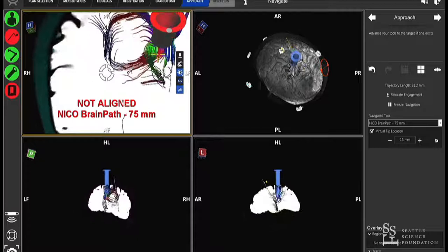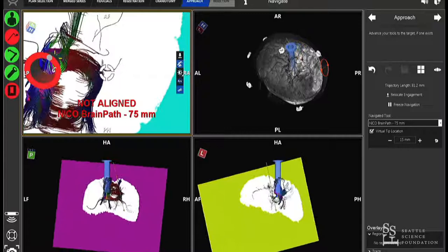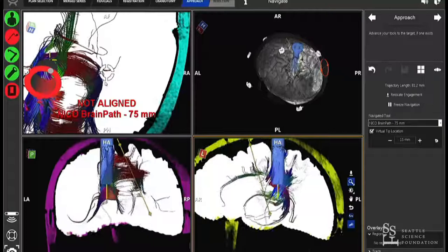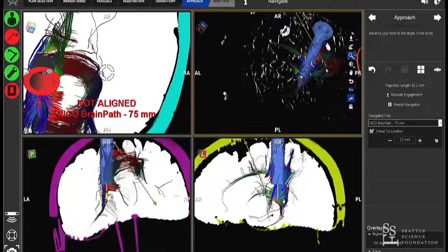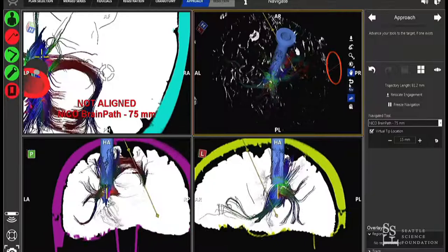In the upper left you can see live tracks being drawn — culled to show only major ones: callosum and pyramidal tracks. The green fibers running front to back are likely the ILF, and you can see SLF fibers on the standard views. The blue are the pyramidal or corticospinal tracks coming down. The software can also warn you whether you're intersecting a major track at a perpendicular angle. Once docked, the trocar comes out and you can still navigate.